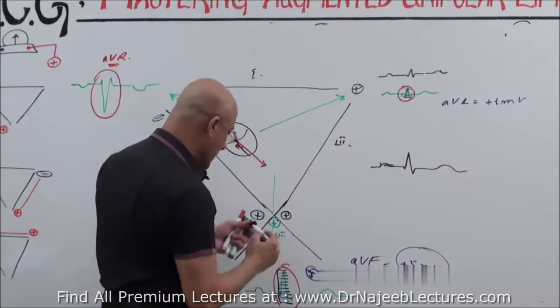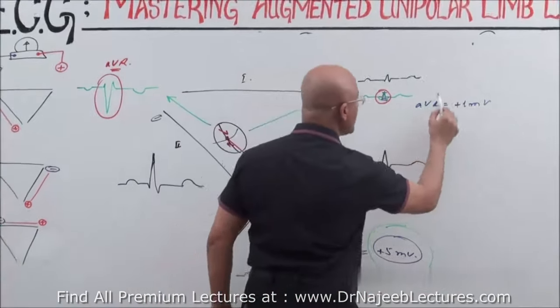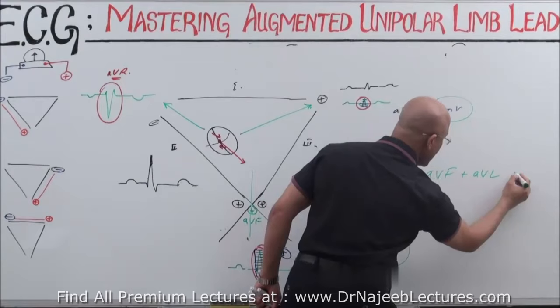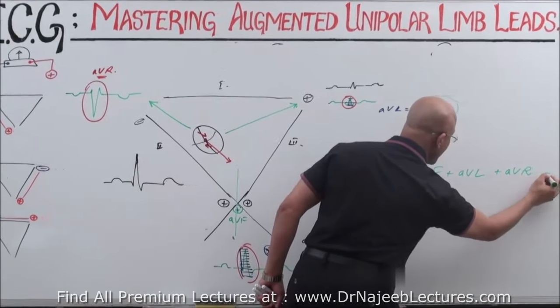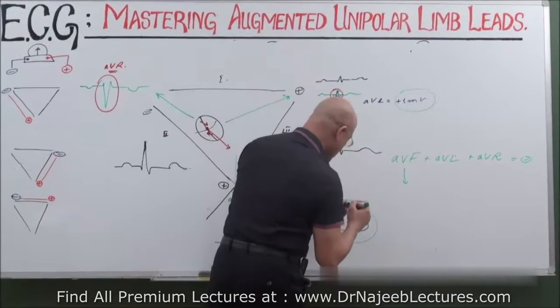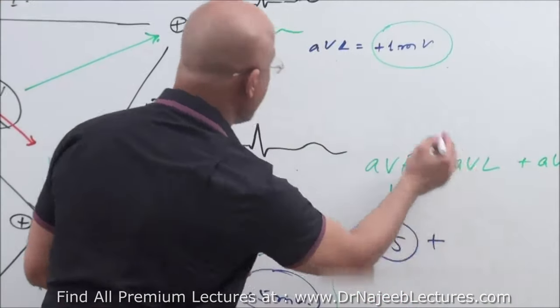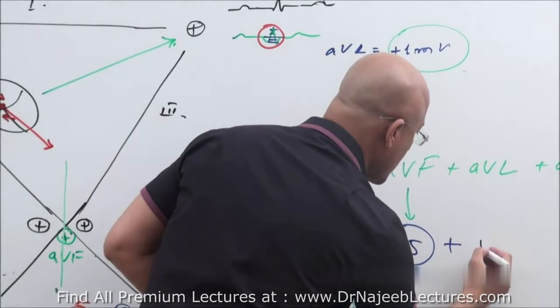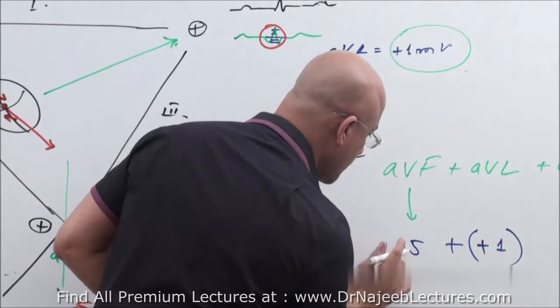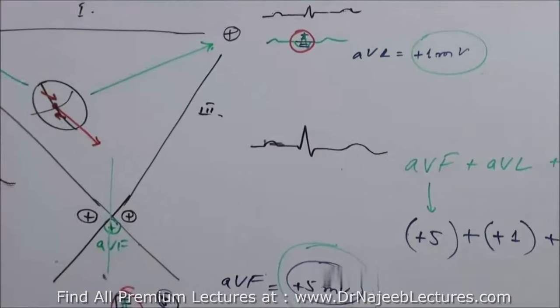Yes. Now you add them together. Now you add, what is this? AVF plus AVL plus AVR should be negative. Now AVF is how much? Plus 5. Now add to this AVL, plus 1. Plus 5. Plus 1. Plus you have to add AVR. It should be minus 6.